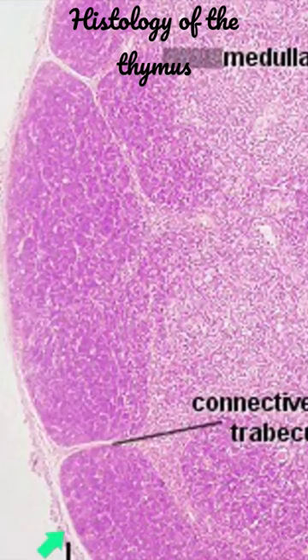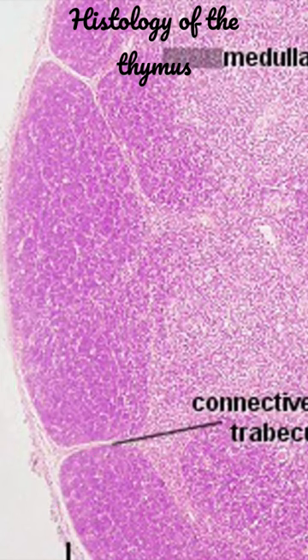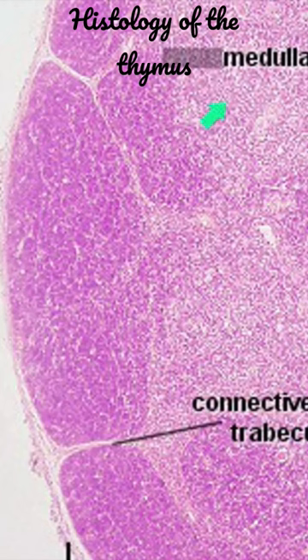In this picture you can see the capsule, and from the capsule you have the connective tissue septa or trabeculae, which incompletely subdivide the lobe into several lobules. Within the lobule you have an outer cortex and a medulla. The medulla of adjoining lobules are continuous with each other.